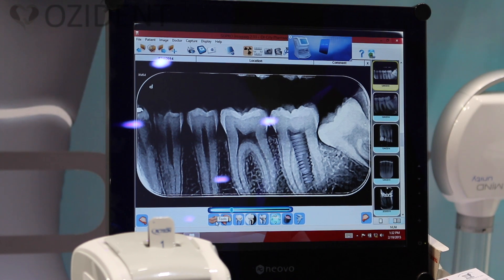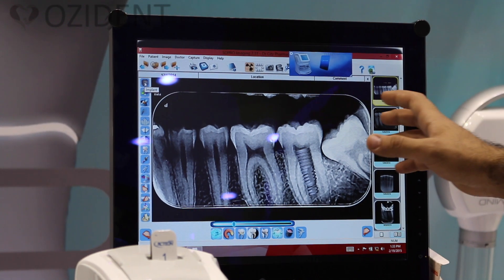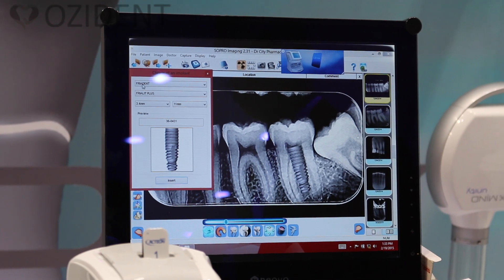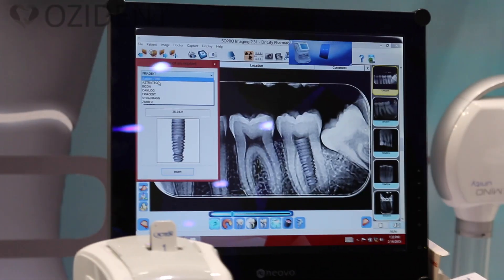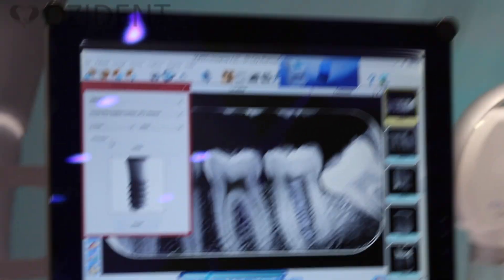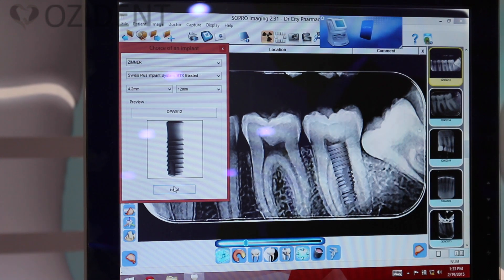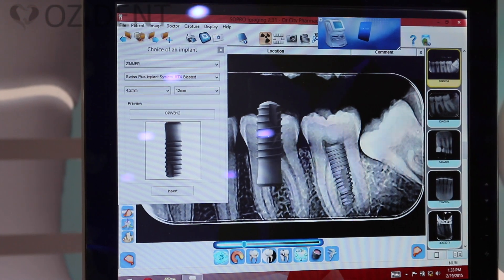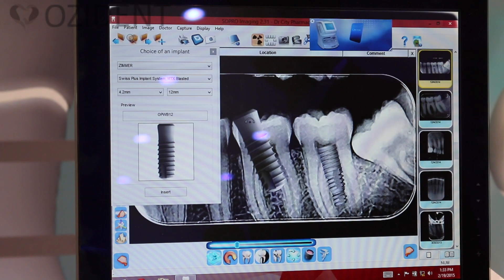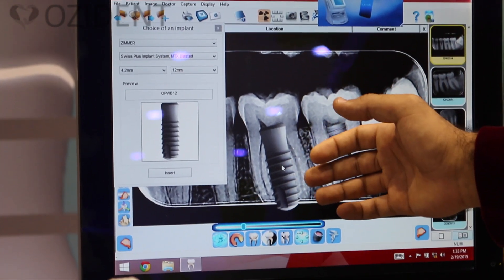Here is the most advanced part — the tools. By clicking on tools you have more options. One special option in this software is the implants tool. You simply click on it, choose from the most common implant systems — for example, Zimmer, Swiss Plus implant — select the thickness and length, for example 12mm, then click insert. The implant overlay appears, and you can move it with the left click and rotate it with the right click, so the doctor has an idea of how the implant will be positioned.